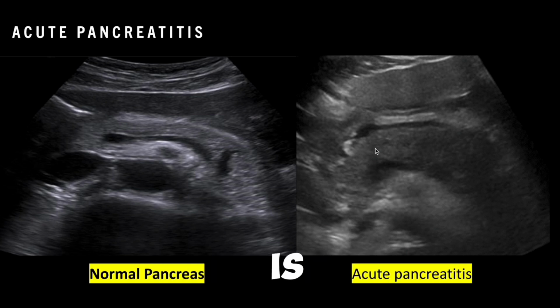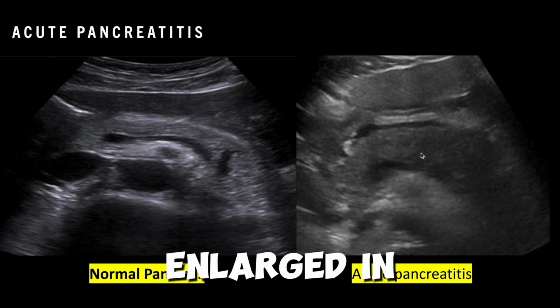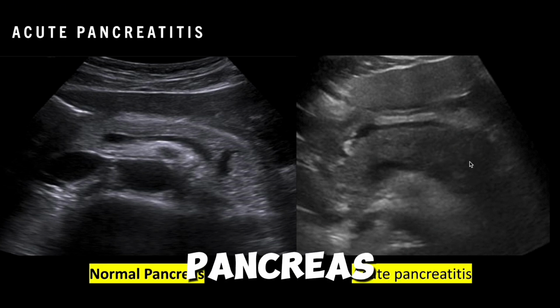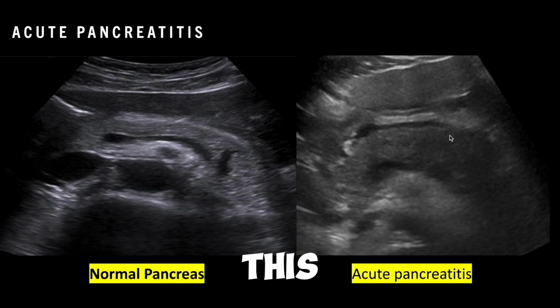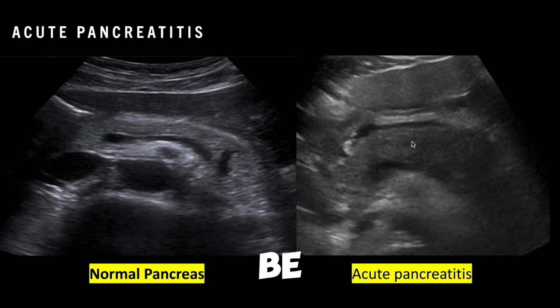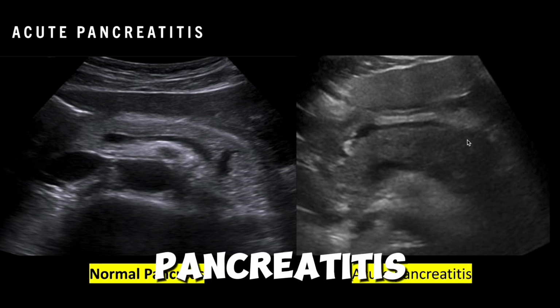The pancreas is swollen. The pancreas is enlarged in size. And if we compare the echogenicity of this part of the pancreas with the liver, we can see this part of the pancreas is hypoechoic compared to the liver. Remember friends, normally the pancreas should be hyperechoic or isoechoic compared to the liver. But if the pancreas is hypoechoic compared to the liver, then we have to suspect acute pancreatitis.